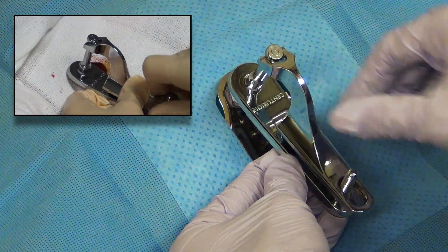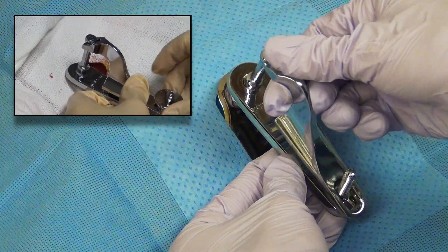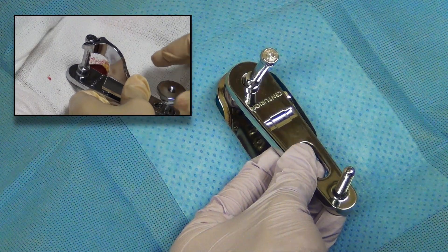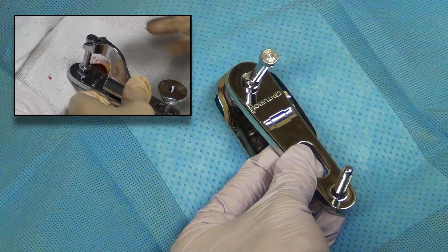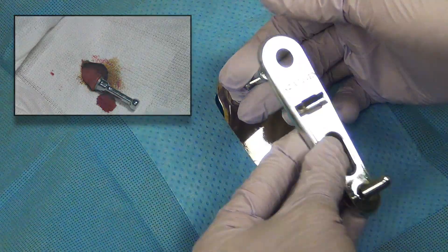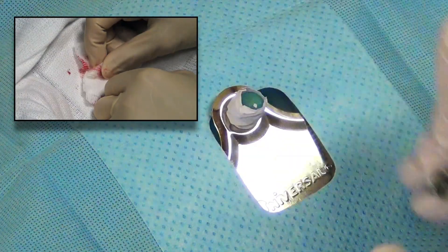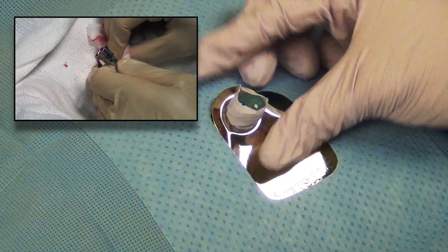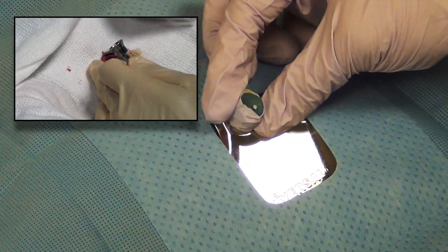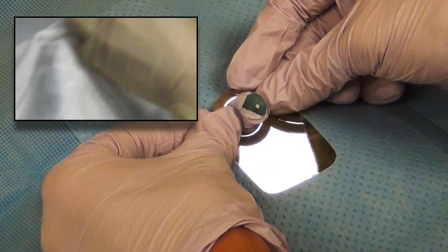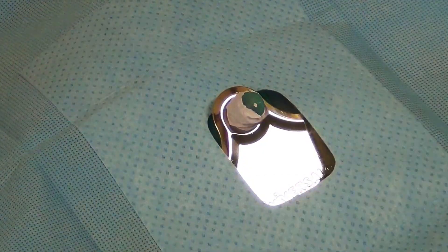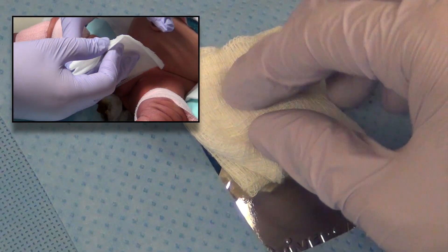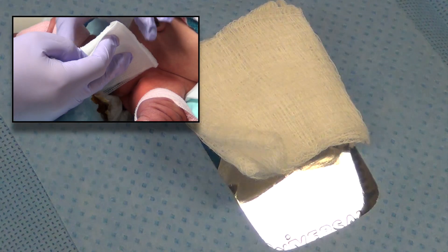The clamp is then disassembled and removed. The bell is then gently removed. Hemostasis is assured and a sterile dressing with petroleum jelly is applied.